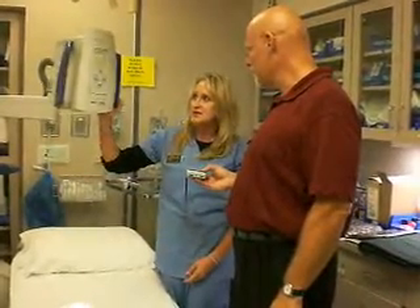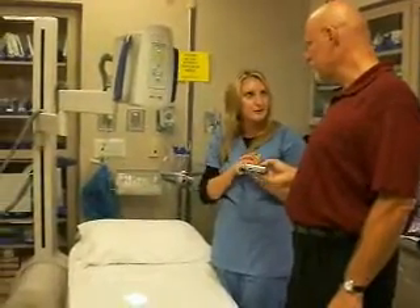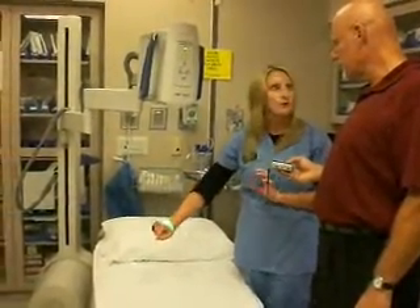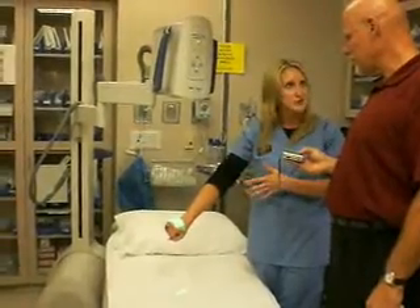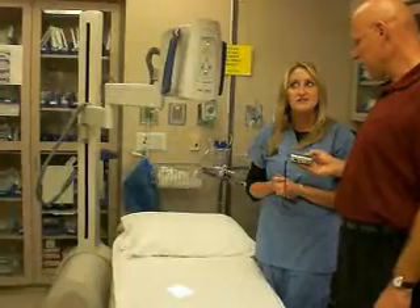This tool helps us see what we've only been trained to feel before. Now we can virtually see a road map of vessels on our skin, directly projected. Clinicians can go directly for a vessel and not have to guess.